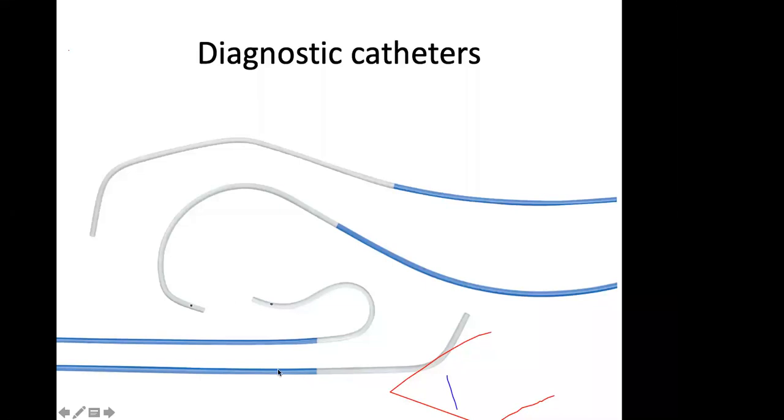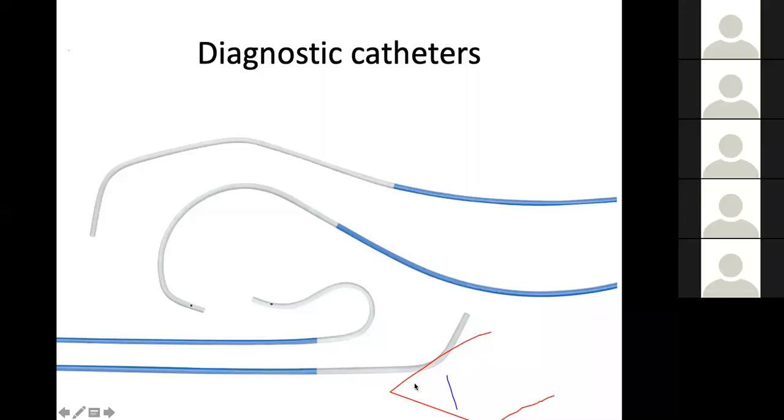And this is an angle tip catheter. You could even call it a multi-purpose catheter because it has a very gentle bend and is quite versatile. If this catheter is absolutely straight, it is a straight catheter. So if you know the shape tips of headhunter, cobra, Sims, a long Sim known as the Roberts, a multi-purpose and straight, that is more than enough.